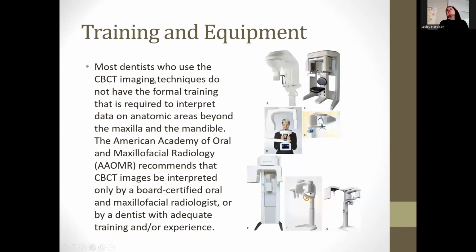So training. Most dentists, I just cut this out of the book because I thought this whole little paragraph was sort of nice to know. I remember Dr. Matsuda when I worked for him for years, I would hear him tell his patients that just because I see something on your CBCT doesn't mean I can diagnose or talk to you about it. He'd say you're welcome to take this and bring it to a physician or a specialist of some other area and ask them about this or that. But he could only talk about what he was actually dealing with.